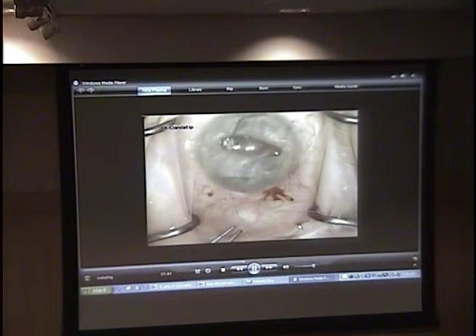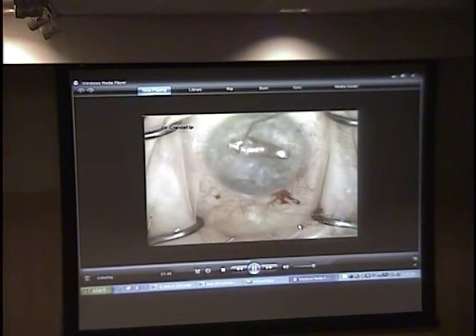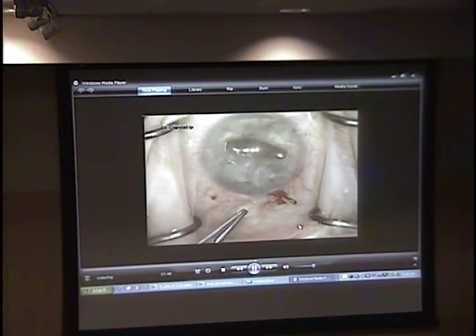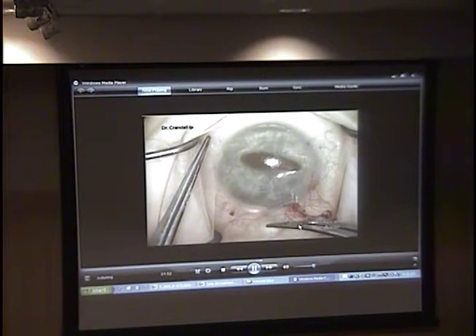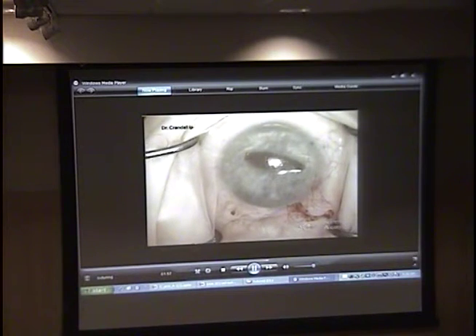So you have a loop and then your suture, and you just need to identify, by pulling on the suture, which part of that loop is attached to the needle, because you want to use the other one to tie your knot. And so it's just a 3-1-1, and then you pull both ends to tie the knot down.